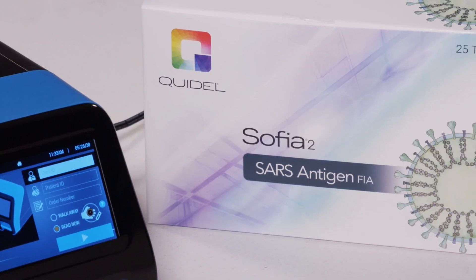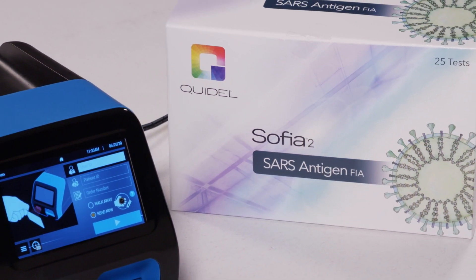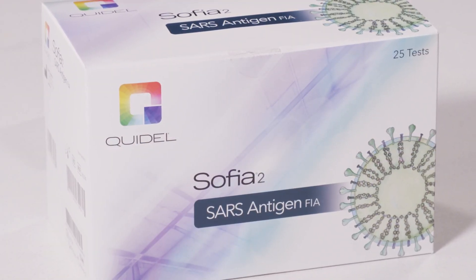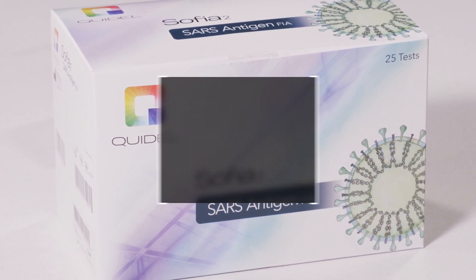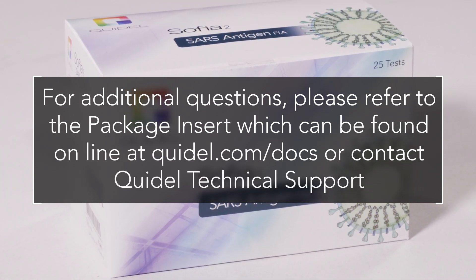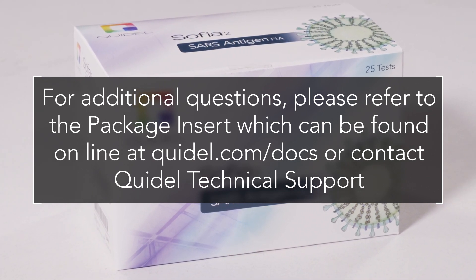This module will provide users guidance on how to prepare patient specimens to produce results on SOFIA2 from nasal or nasopharyngeal swabs. The assay used in this demonstration is the SOFIA2 SARS Antigen FIA. For additional questions, please refer to the package insert, which can be found online at Quidel.com/DOCS, or contact Quidel Technical Support.